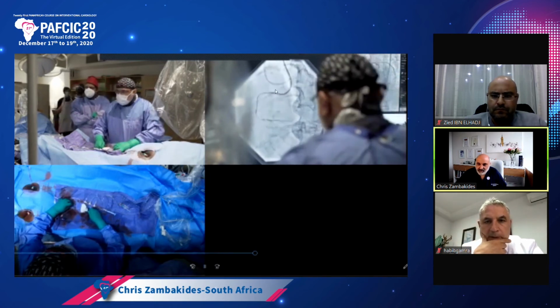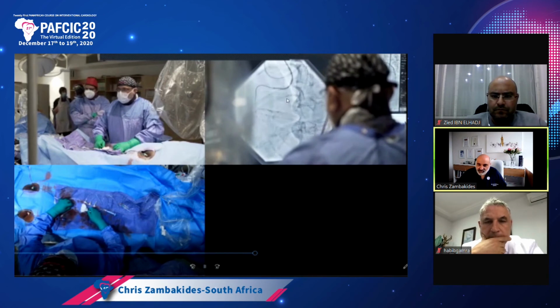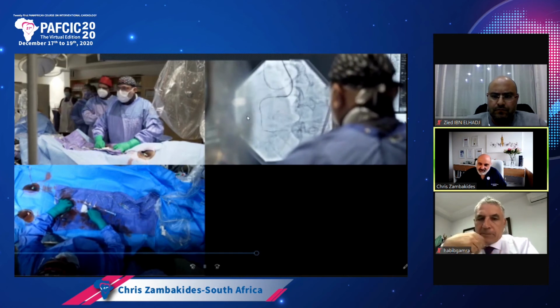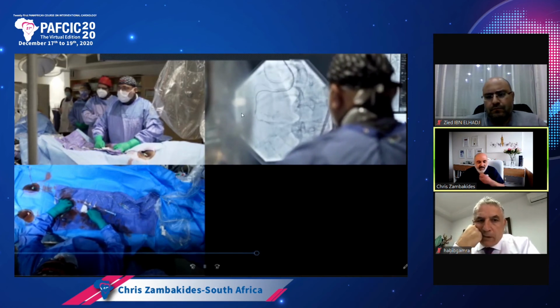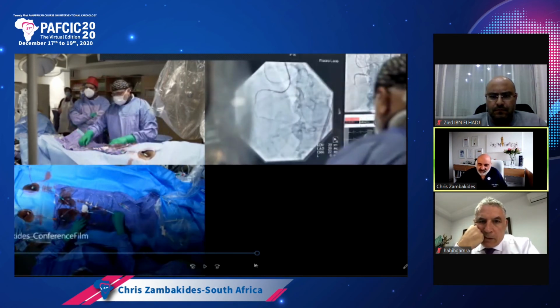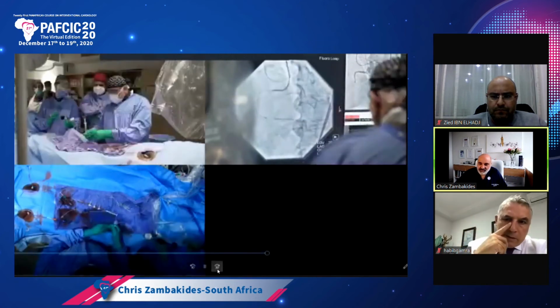That's a hard cap there. The major problem was even though this was an AL1 and we've got the microcatheter and the wire down, we just couldn't go through the cap. So again, that was the previous talk that was given. How do we increase our support? Yes, we could upgrade to a 7 French, but the other way you can do it is put in a guide extension and balloon to trap it.